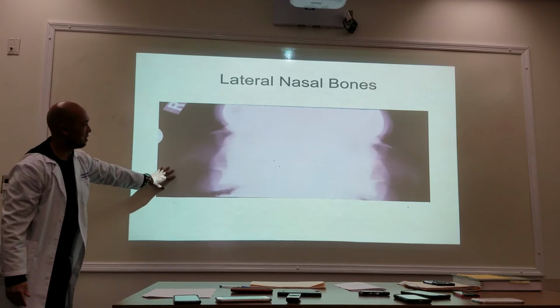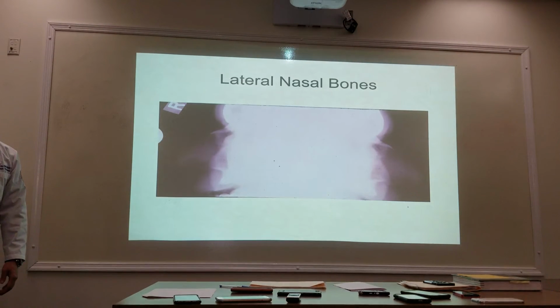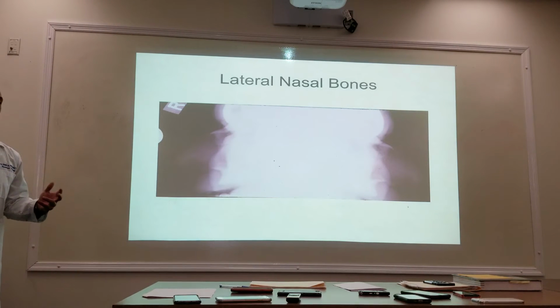This wasn't a Cypress College student. Done by somebody else. Okay. So mark your films appropriately. If you're doing bilateral, make sure you put a right on a right lateral and a left lateral so the doctor will know which is which. Okay?